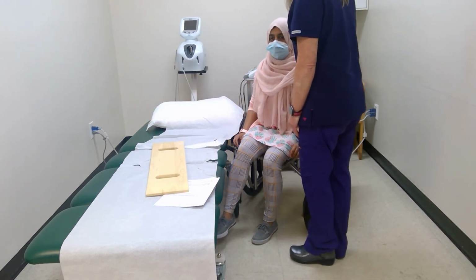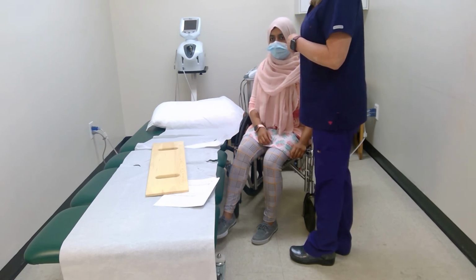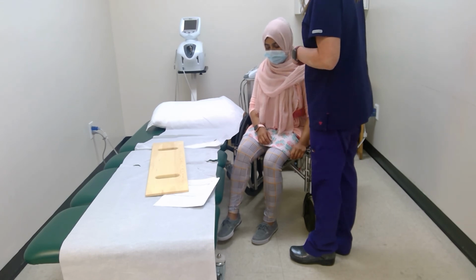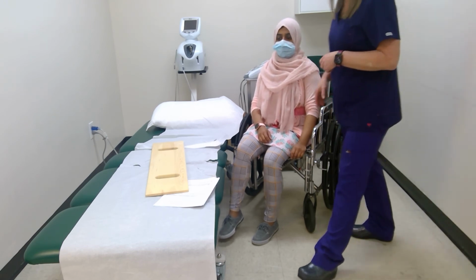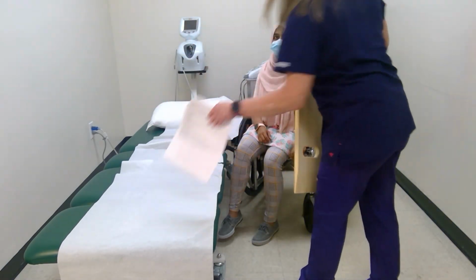Then after that, you could also bring the IV pole around at this point in time too. And sometimes I bring it before I even start moving. So now that we have her sitting in the wheelchair, we would put the armrest back on. Okay. And then that's it.